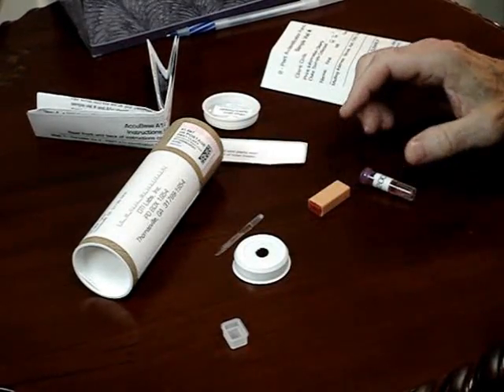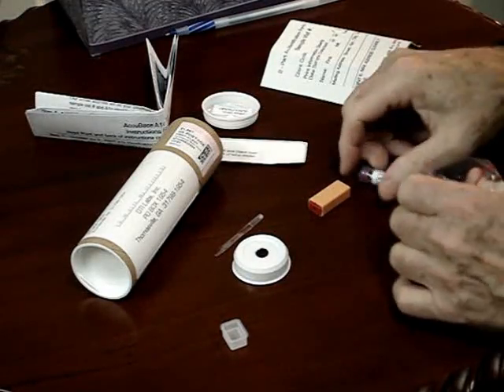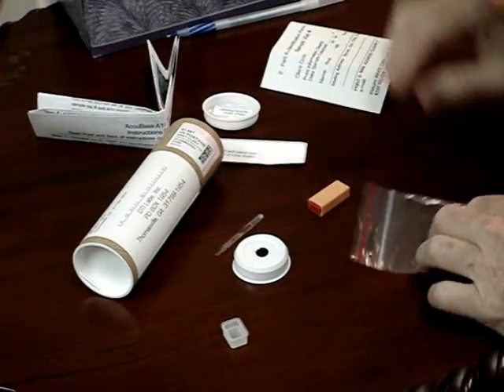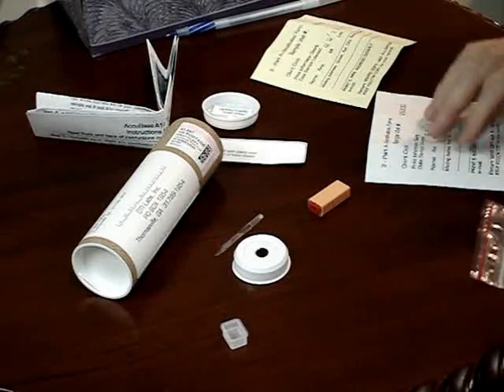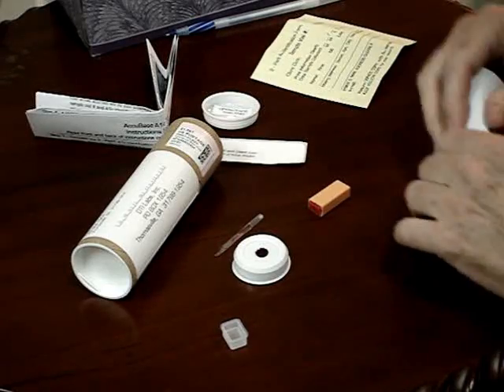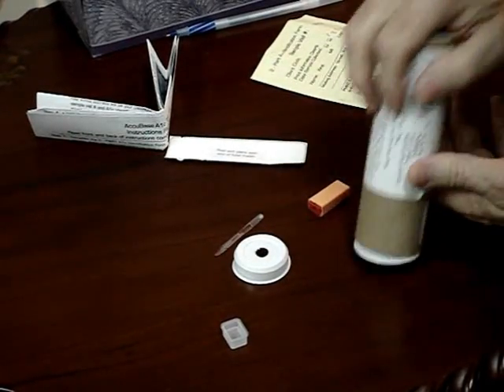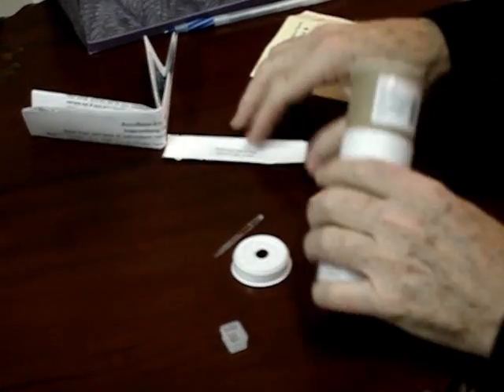Place the reagent vial with the sample into the Ziploc bag. Seal along the seal line. Now, place your white copy of the lab form along with your vial in the tube mailer as shown. Next, place the cap back on the tube mailer and it will be ready to mail.